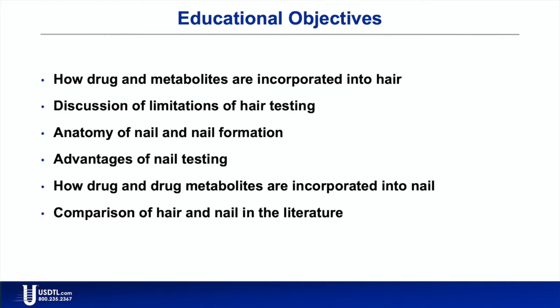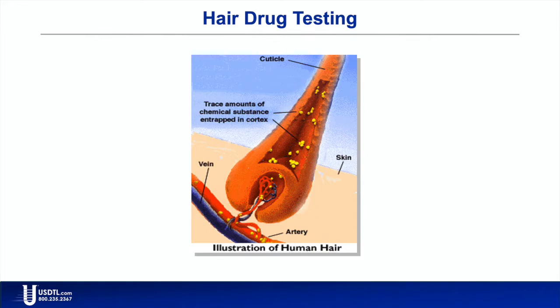Hair testing has been around for several decades. As you can see from this diagram, drug is incorporated into the hair, and then once you cut the hair, the drugs are trapped in the keratinized proteins and are available for us to extract out and analyze.